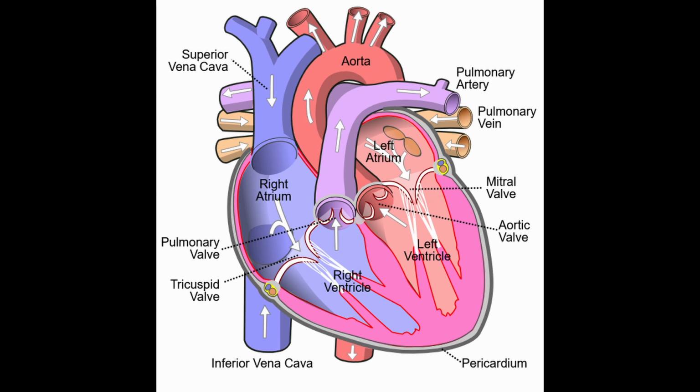Now the distal port of the catheter is measuring the pressure beyond where the balloon is. If you think about the balloon wedging in either the right or left pulmonary artery, the distal pressure measurement is going to be effectively the left atrial pressure. This is because the balloon is occluding the pressures coming from the main pulmonary trunk and everything behind that, and the only pressure that you're measuring is through the lung and from the left atrium on the other side of the circulation. This allows you to functionally get a measurement of pressure of the left side of the heart without having to do a transseptal puncture or cross into the left side of the heart.